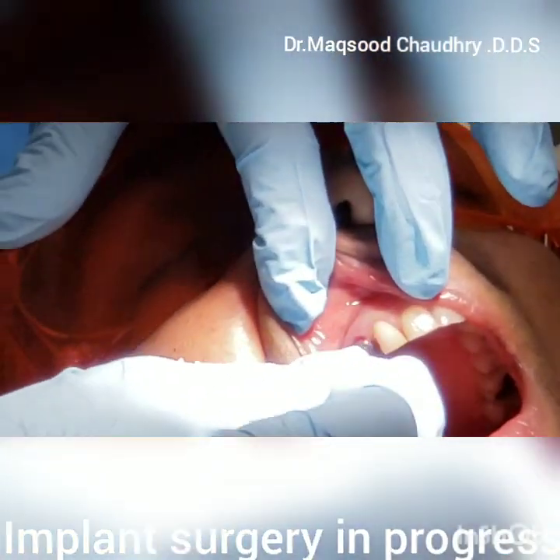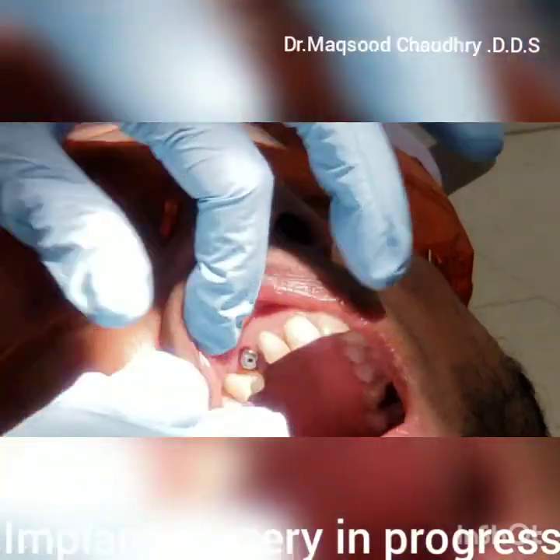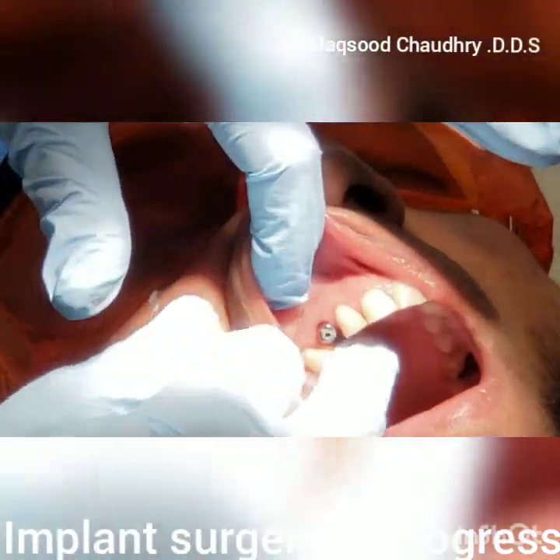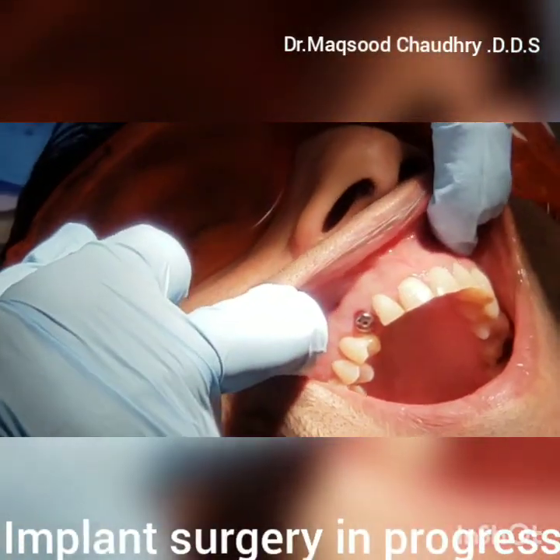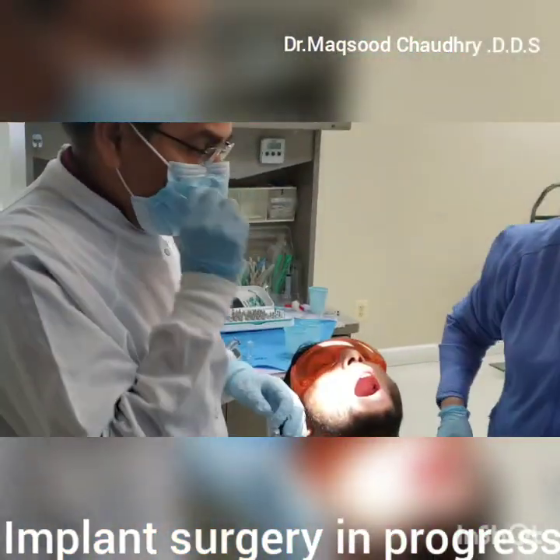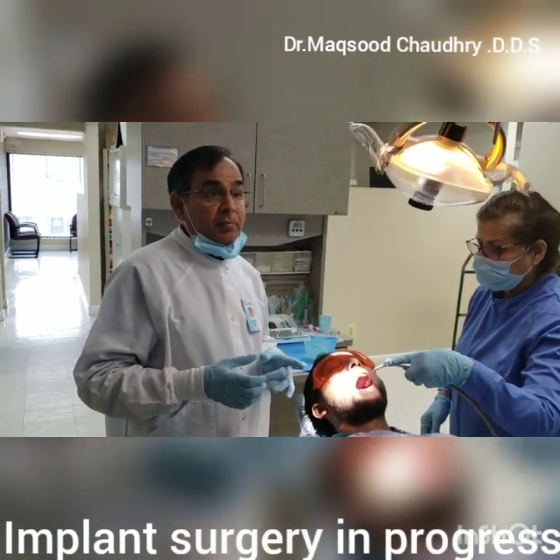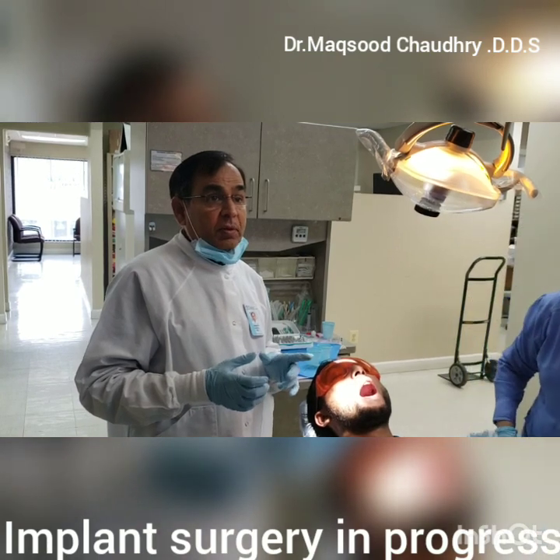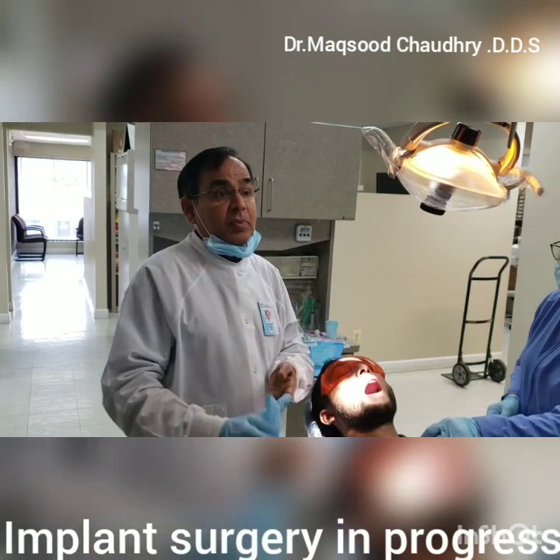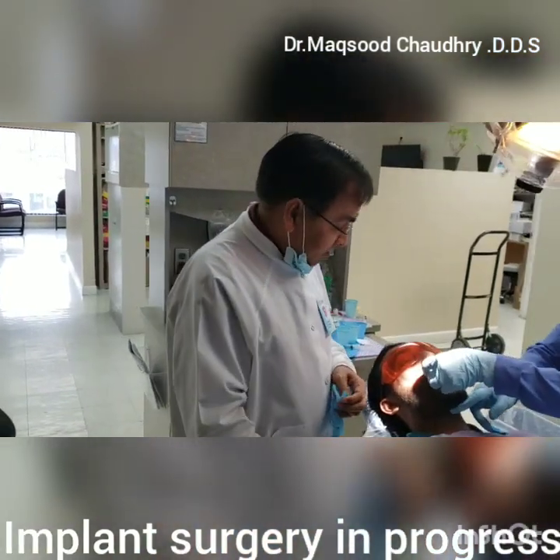The insertion of the healing abutment is in. Implant surgery is all done. There is no bleeding. Looks perfectly fine. So this is a more predictable and precise way of doing implant surgery after we make the surgical plan. This was one of the very challenging cases because of the depth of the impacted cuspid tooth, but it went very well. And we have a great patient. Thank you for your help.